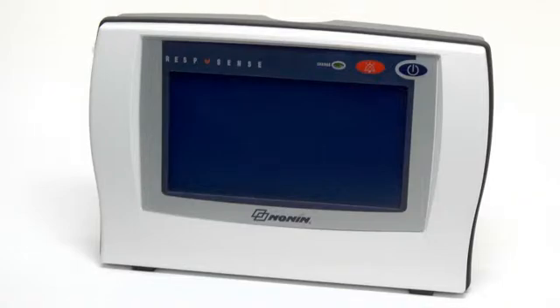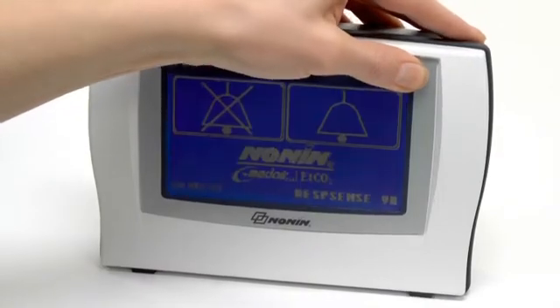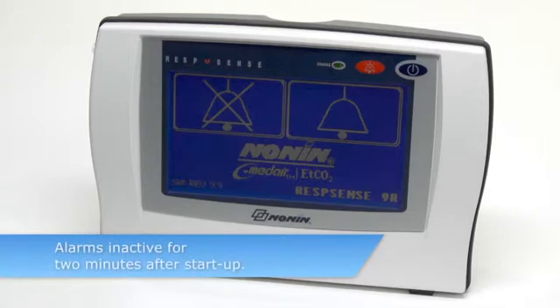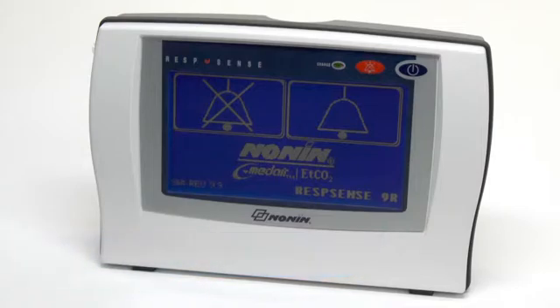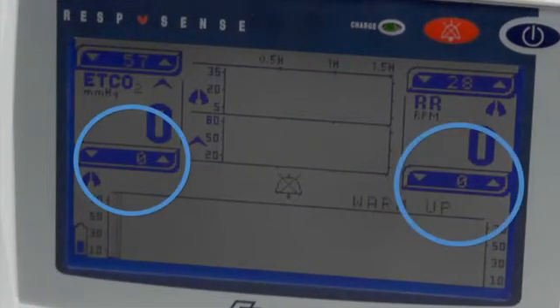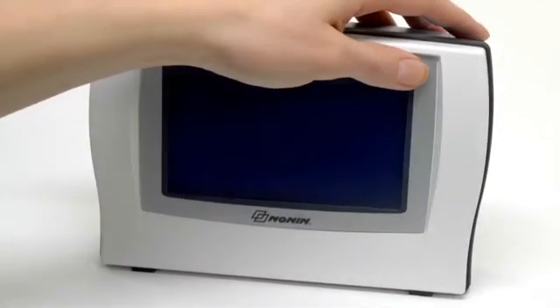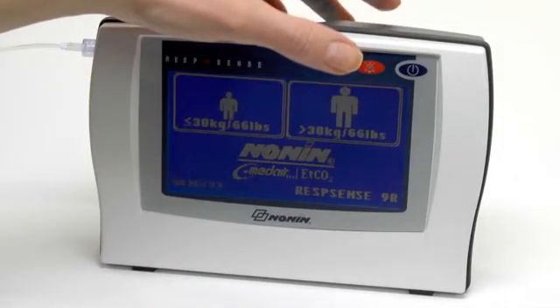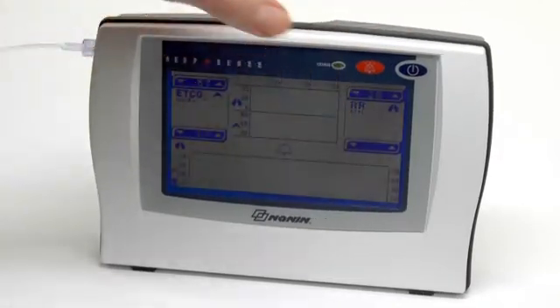Turn on the RespSense Monitor by pressing the on/off button in the upper right corner until you hear a beep. The monitor will run a brief self-test. After a few seconds, you will see several entry selection screens to choose initial settings. Alarms remain inactive for two minutes after starting the monitor. The first screen allows you to enable or disable alarms. The disable alarms icon drops all minimum alarm values to zero; the enable alarms icon sets alarms to the default limits. The next screen lets you choose the patient size, after which you will see the main monitoring screen.